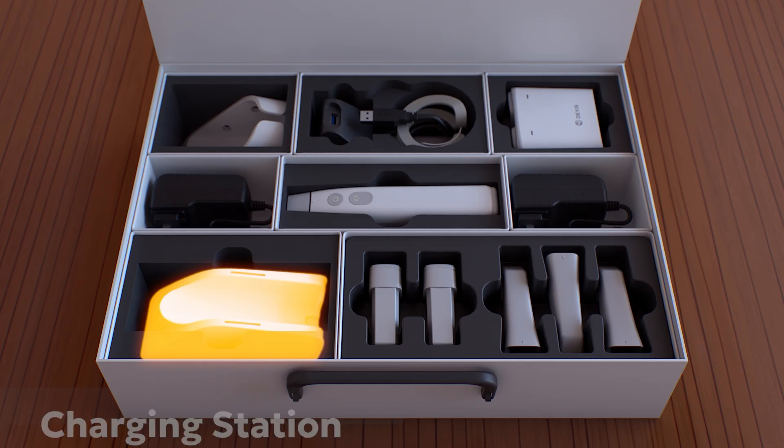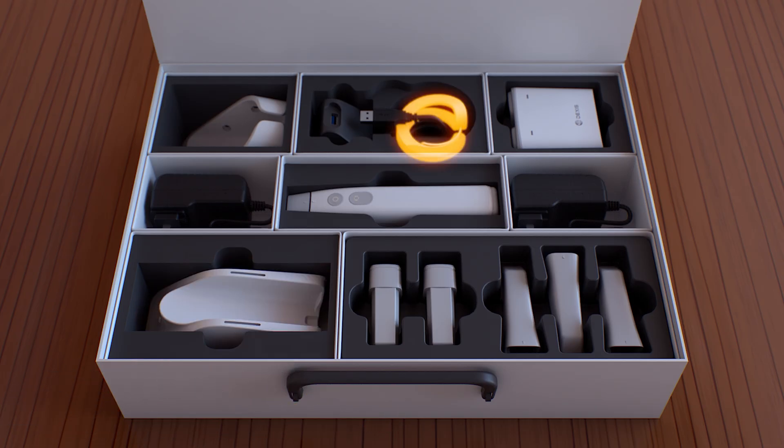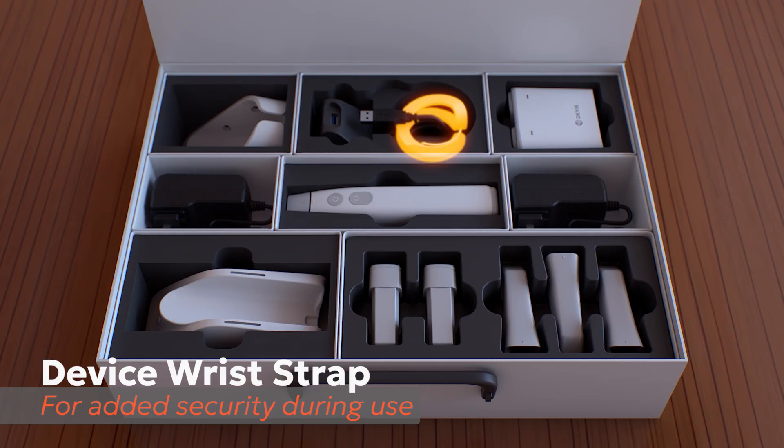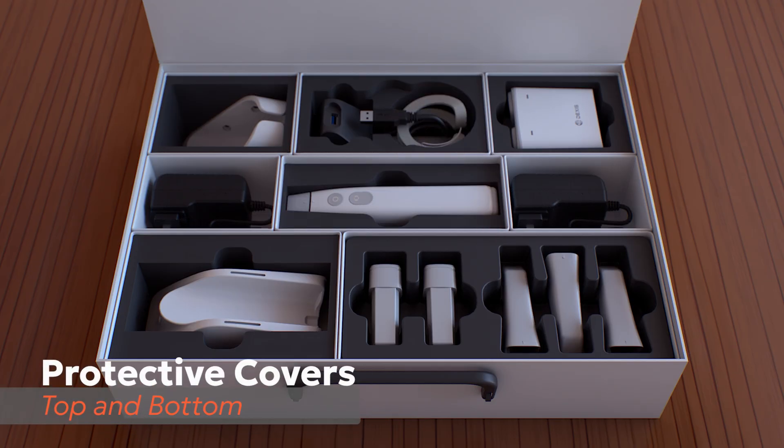Also included are two power adapters, the charging station keeping your scanner safe, charged and ready, a wrist strap for extra security during use, and protective covers to safeguard the scanner when not in operation.